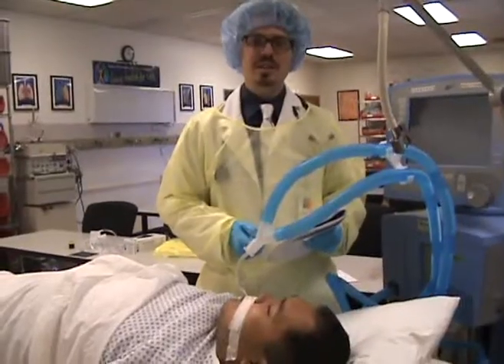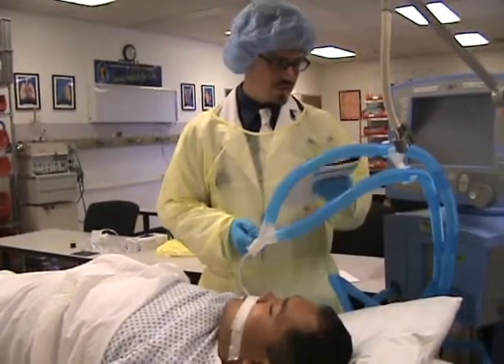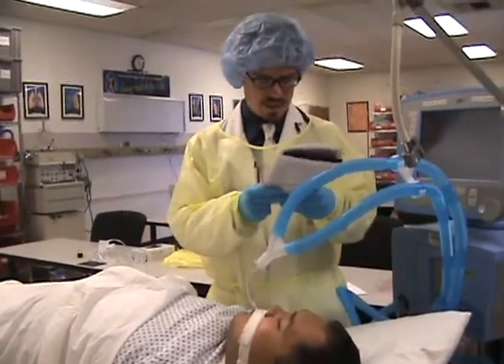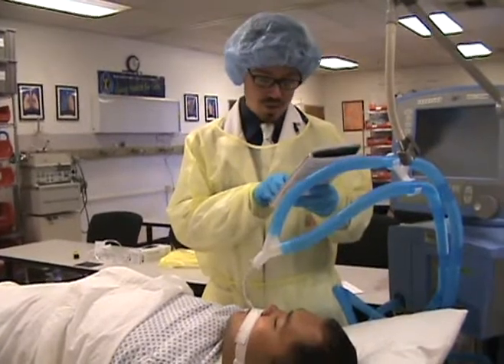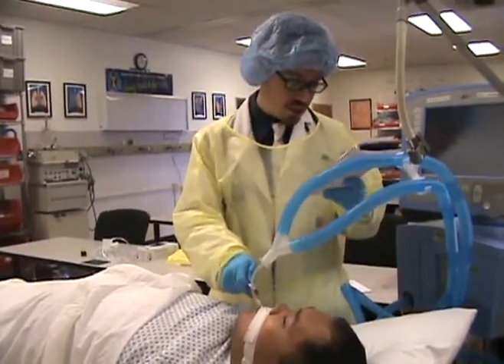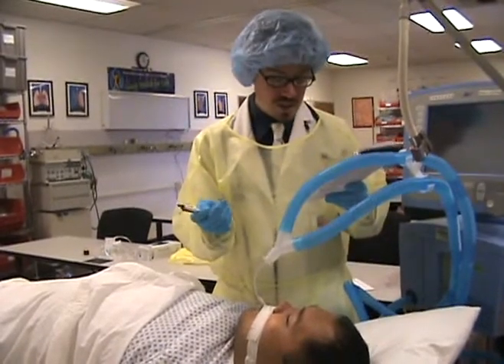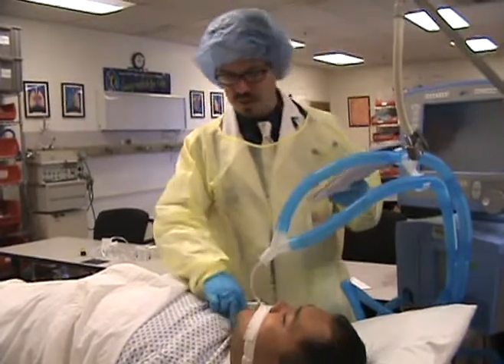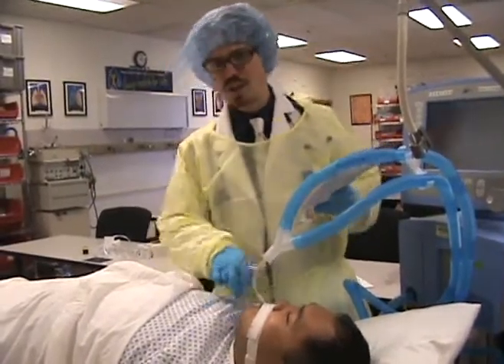Step nine in your ventilated patient's care will consist of performing airway care. For that, you're going to observe and record tube placement, change the tube or position if necessary, and perform trach care if indicated. This patient is not trached, so we're not going to do that.